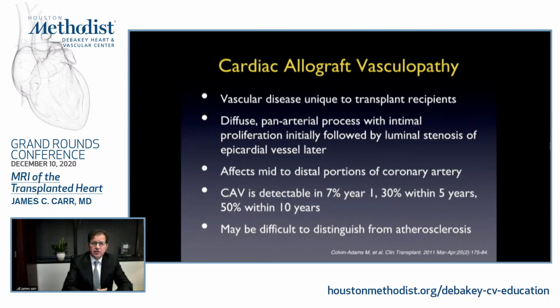The second complication I mentioned is cardiac allograft vasculopathy. This is a vascular disease which is unique to transplant recipients. So it results in a diffuse pan-arterial intimal proliferation. Initially, that is the first finding, and this eventually results in luminal stenosis of the epicardial vessel.